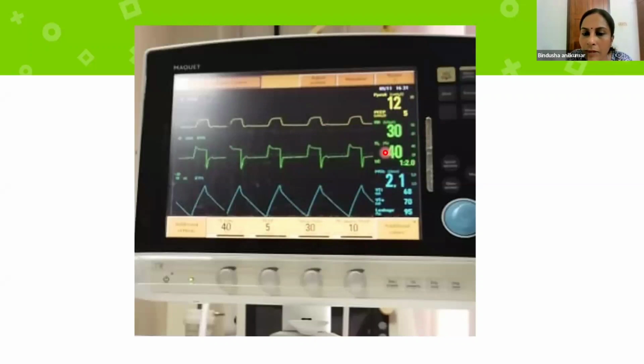Here you can see the FiO2, then the minute ventilation. Here you can see the tidal volume both during inspiration and expiration. So all these things will be there. These are the delivered values, which are seen in the side panel. I just wanted to tell you that. And this is the value which we are setting.